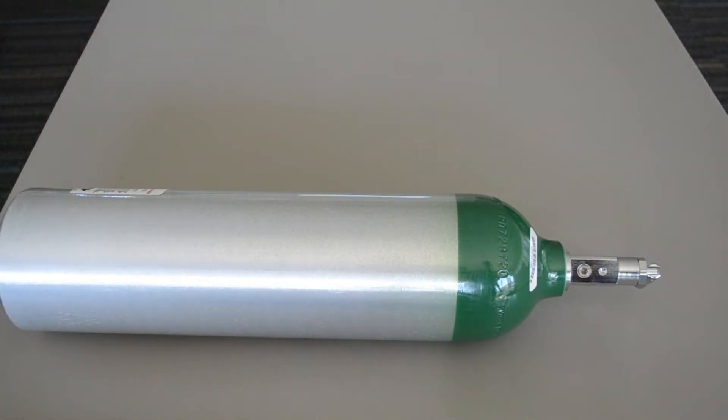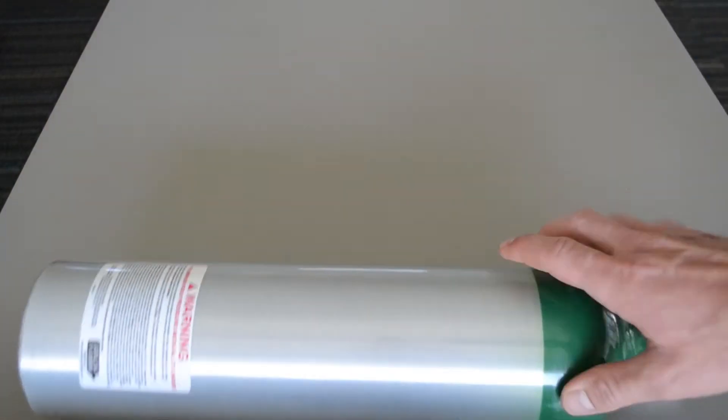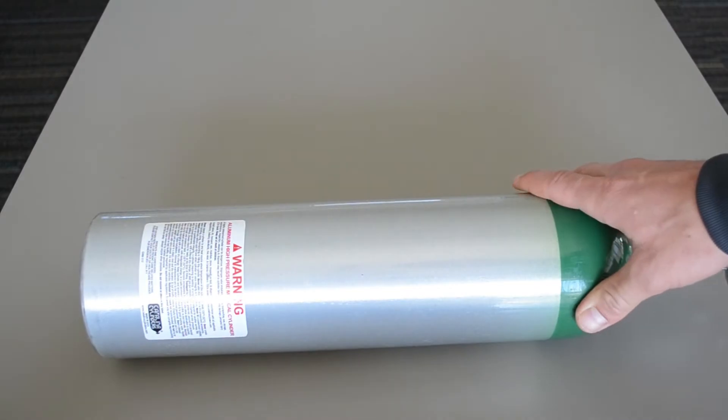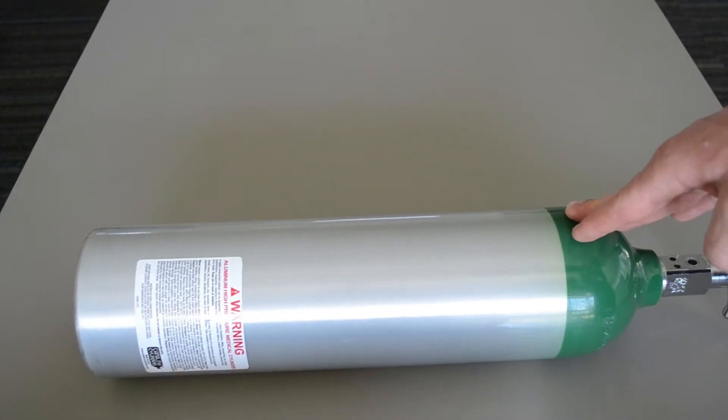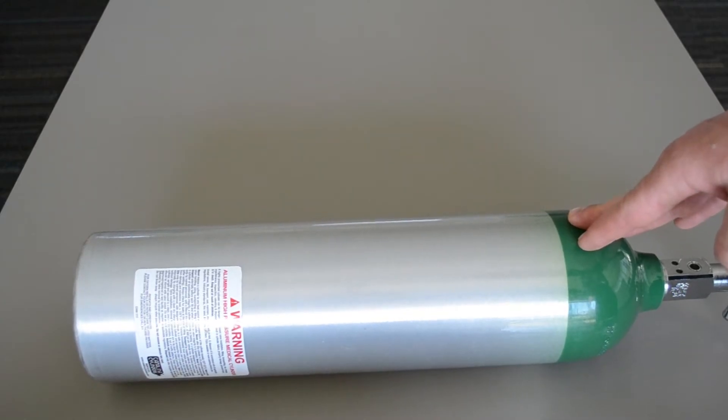All right, so this is your standard O2 cylinder you're going to see out in the field. This is a D-Tank that denotes the size, there's several different sizes. This is something you will take portably with you on scene.